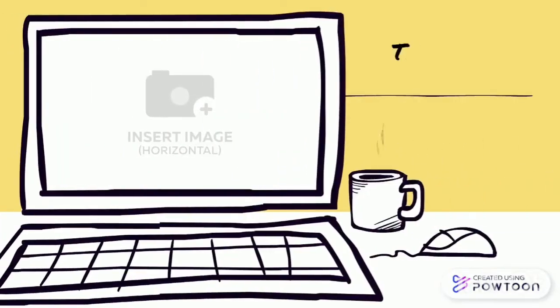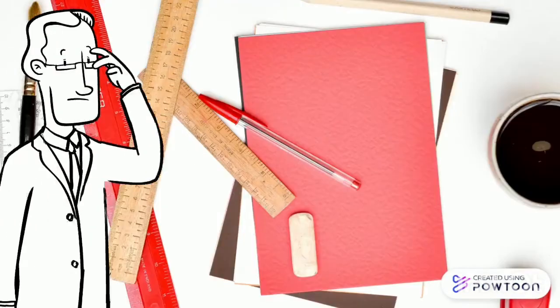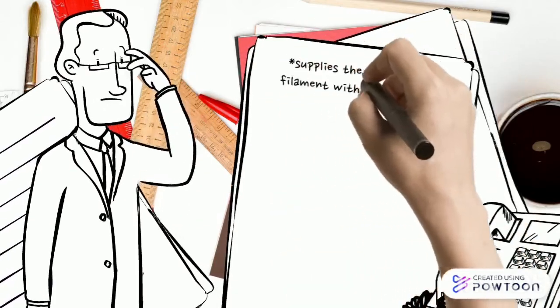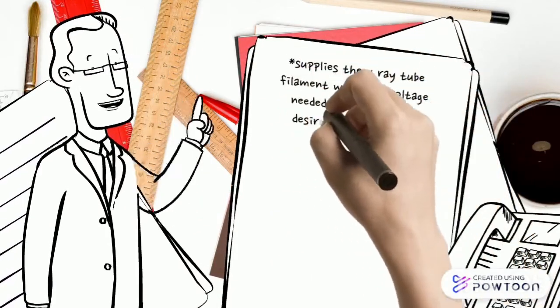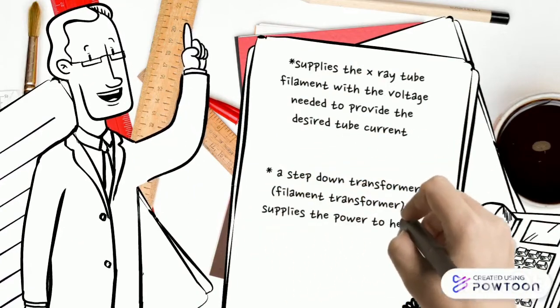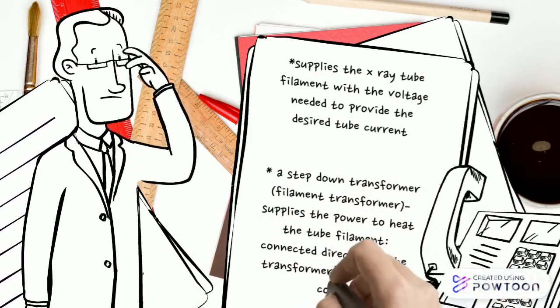The other type of circuit is the filament circuit. The filament circuit supplies the X-ray tube filament with the voltage needed to provide the desired tube current. Filament circuits also have a step-down transformer, which is the filament transformer.